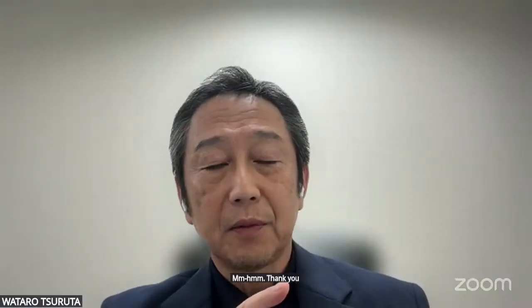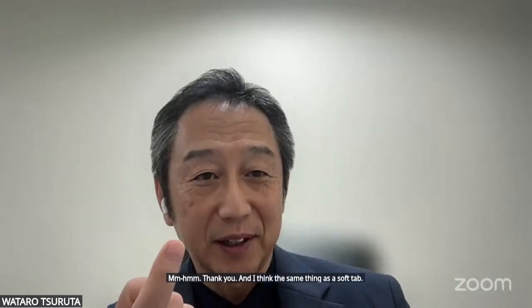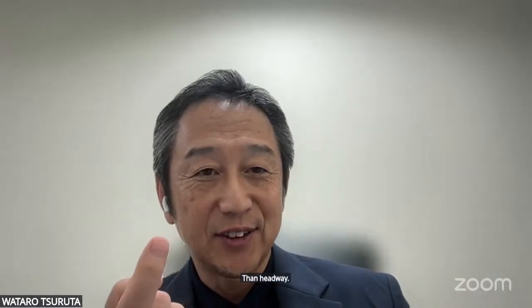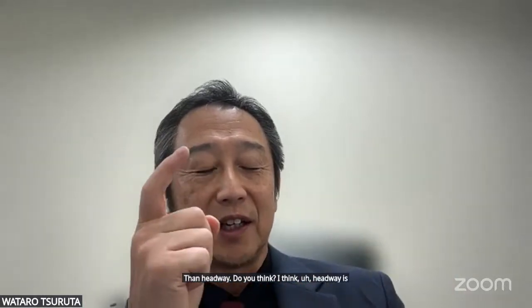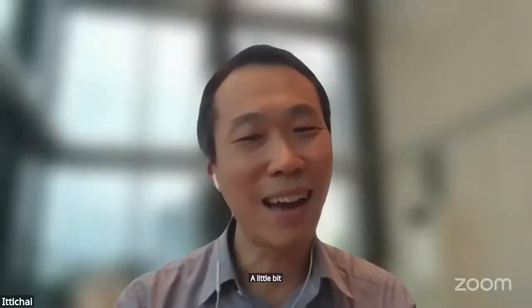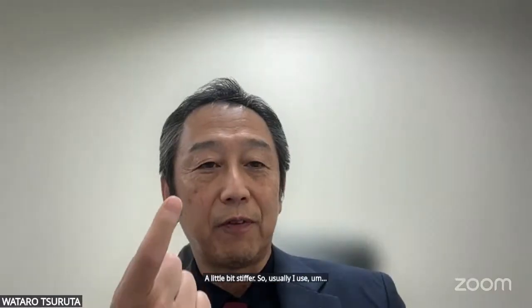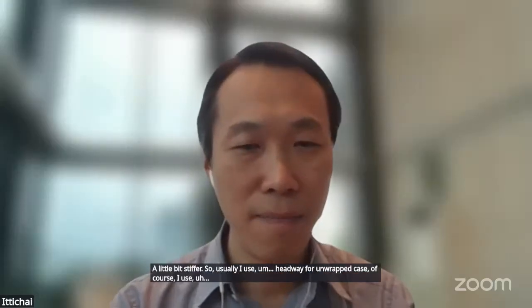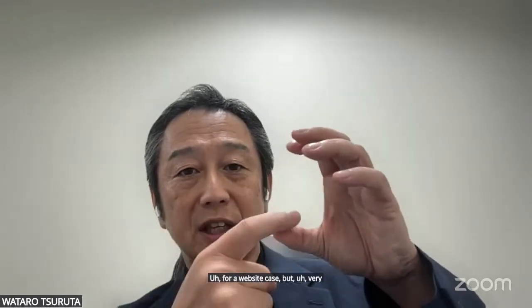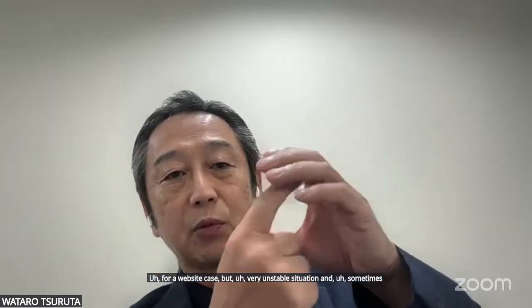Thank you. But I think SL10 is softer than Headway. Do you think so? I think Headway has a very good memory shape, but it's a little bit hard. So usually I use Headway for unruptured cases. Of course, I use it for ruptured cases too, but in a very unstable situation, sometimes the tip is against the wall.